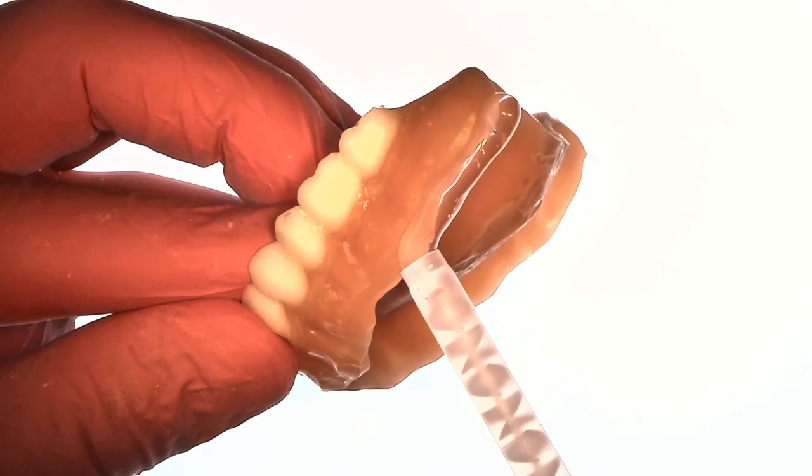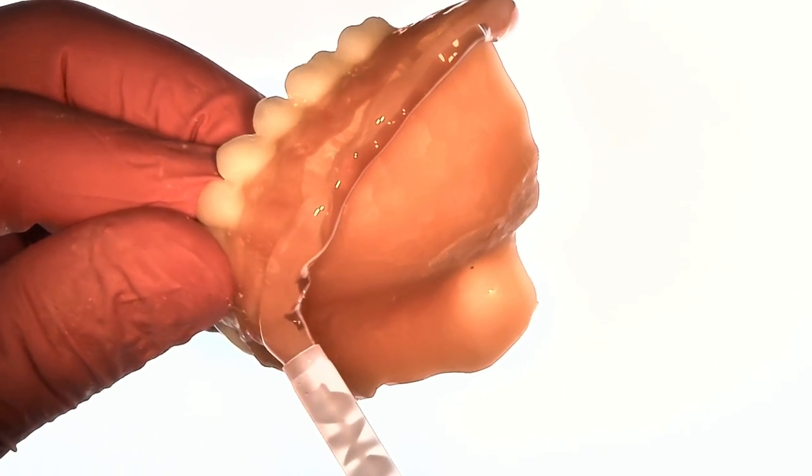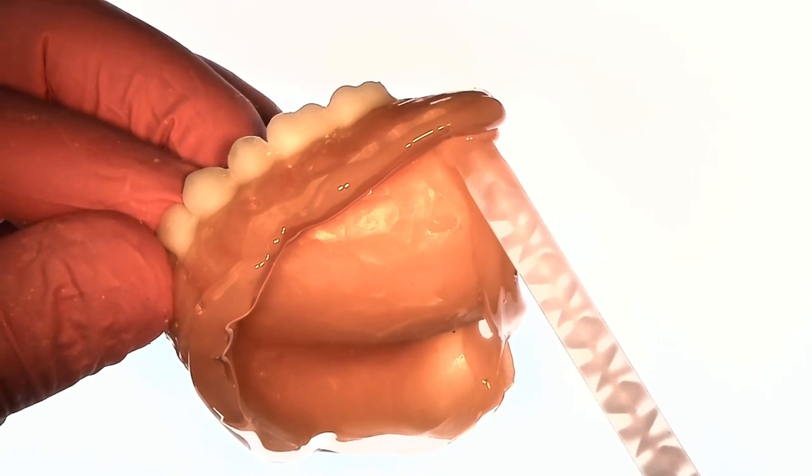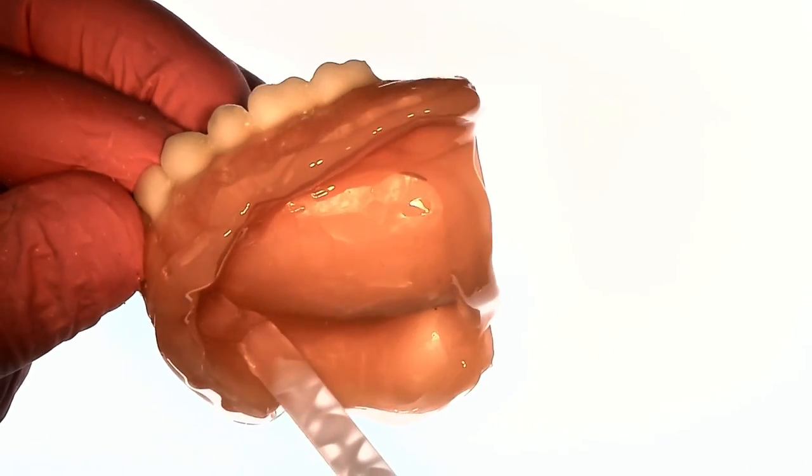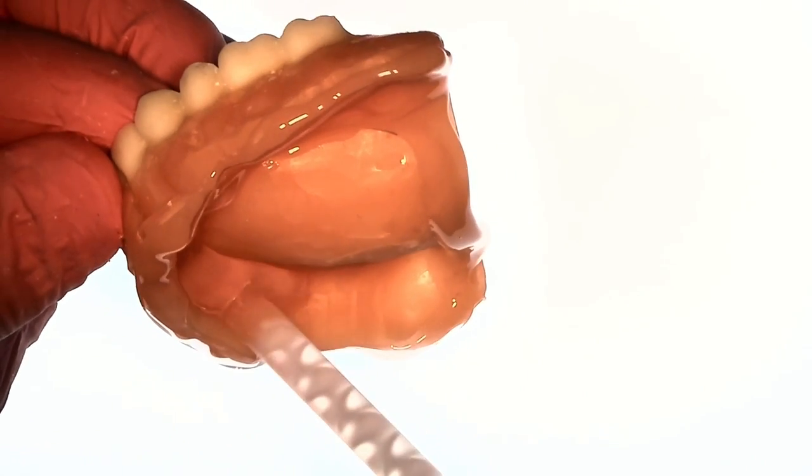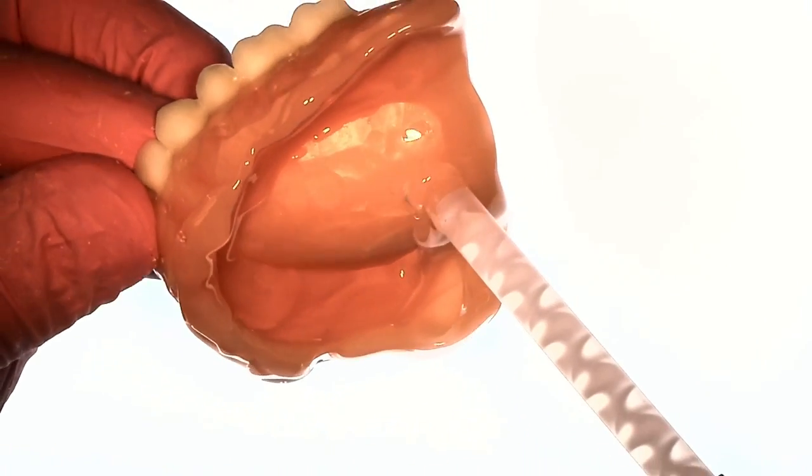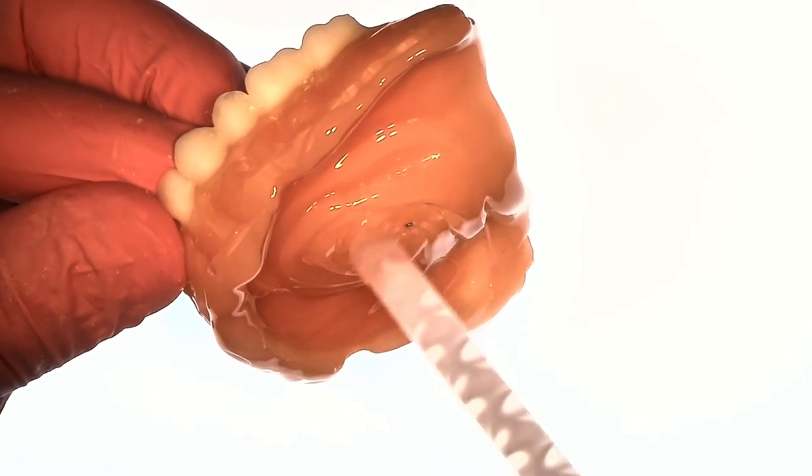The material appears clear, it's like a pink clear. What you're going to do is I first go along my borders and I always keep the tip as close as I can to the denture to avoid air bubbles. I go along my borders really quick and then I try to quickly fill in the rest, always keeping the tip of the reline material pressing down into the denture base material to avoid air bubbles in the surface of the reline and using the tip to kind of spread around the material.